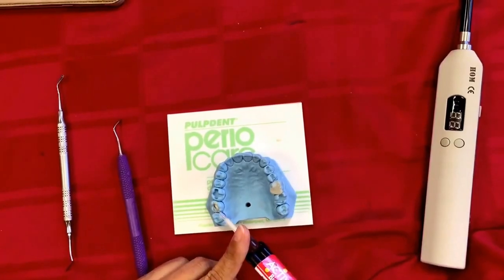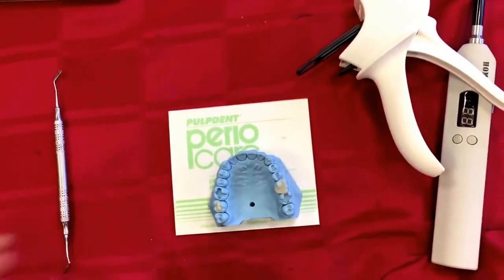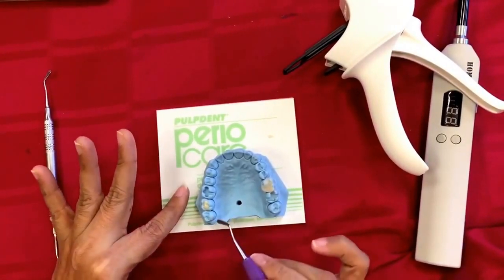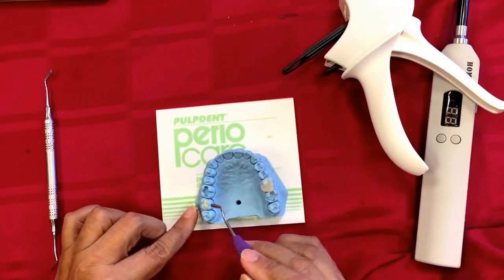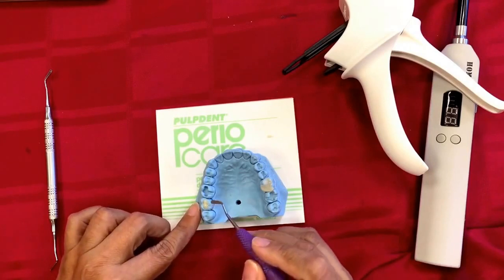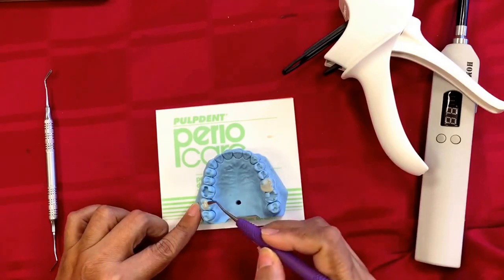We are done — bring it up. It's dual cure, so self-polymerization has begun as soon as Activa comes in contact with the tooth structure and integrates. Let it seat for 20 seconds before you light cure it.